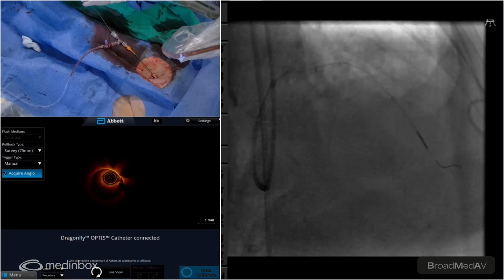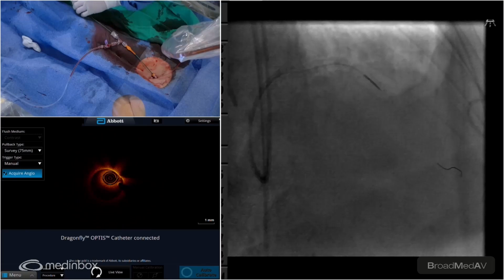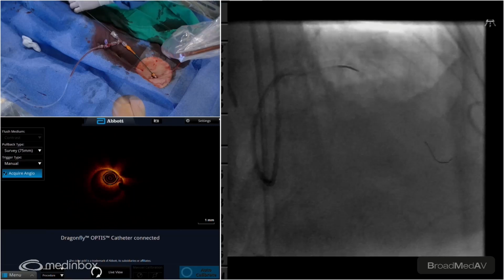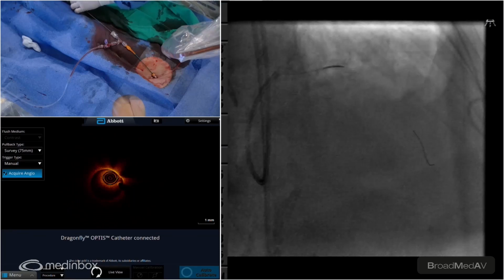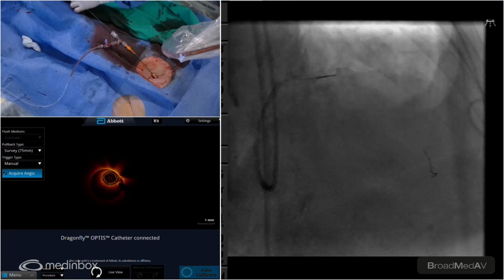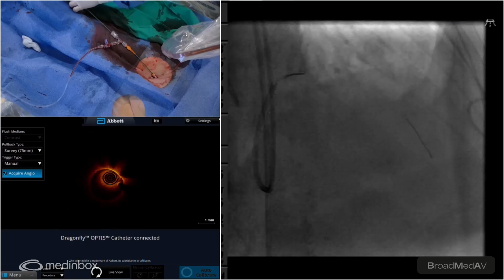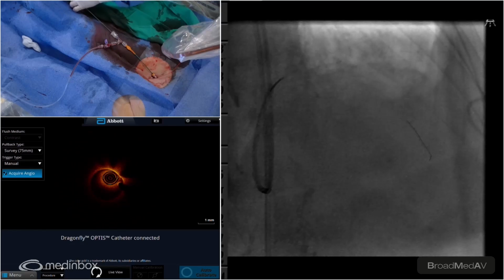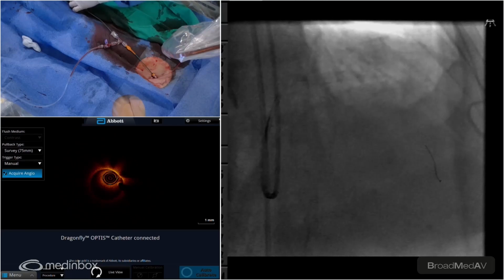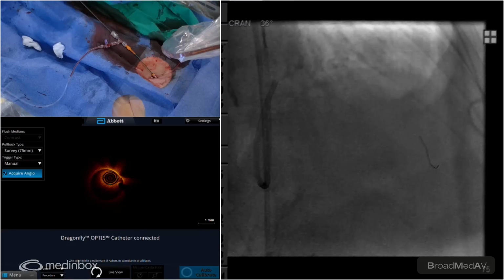That's looking good for us. And I think we did enough modification. Let me just see if I can walk this back. When it gets to the braided part, or should I say the spiral part of the microcatheter, it does create a lot of traction. So you have to maybe walk it back, give it a nice little counterclockwise turn without pulling the wire back too much. Perfect. Keeping my eye on the wire. Walk it back.